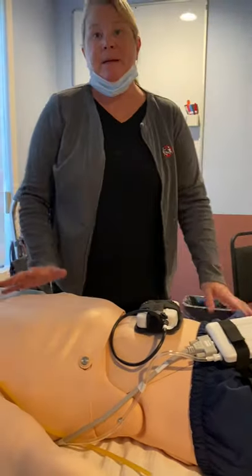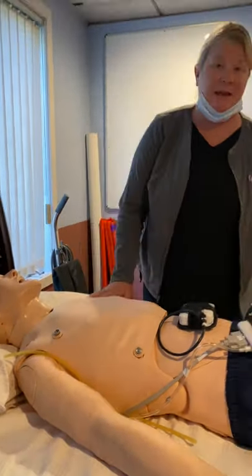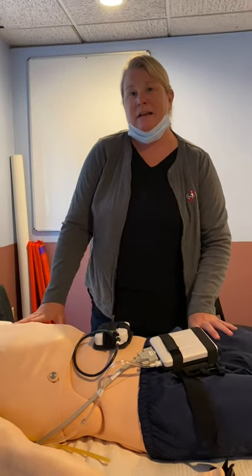Today I'm going to review the Lairdell Megacode Kelly with SimPad Plus — the functionality of the mannequin, how to connect him, get him started, and how to run him.